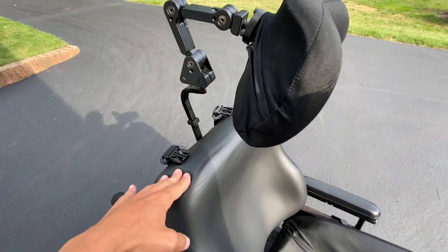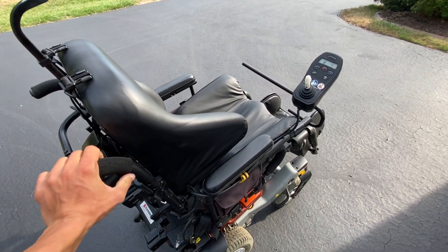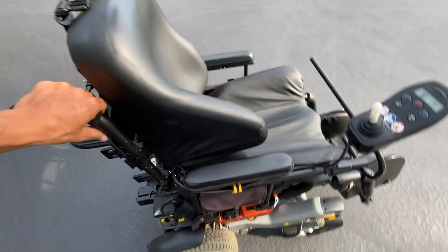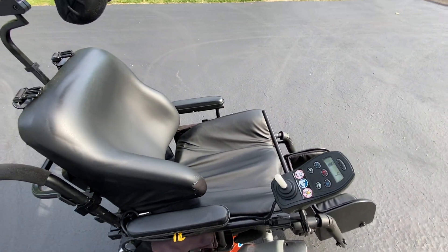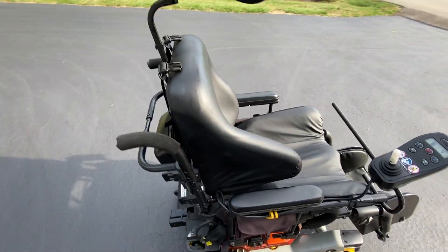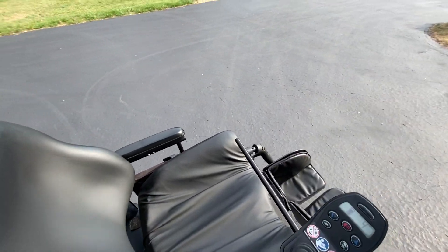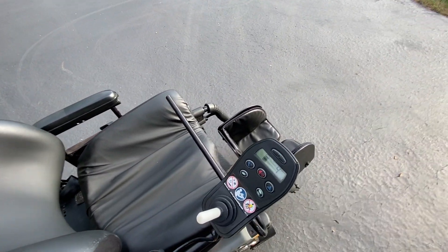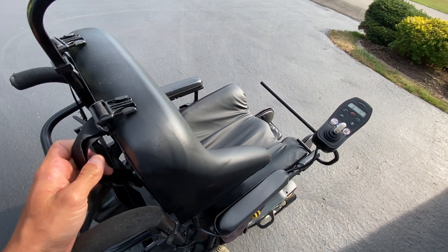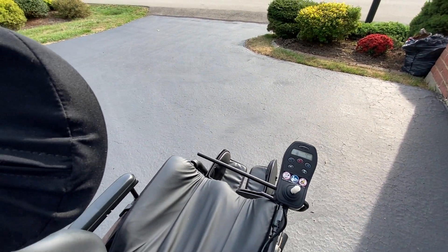My grandpa got this for $180 at a Salvation Army here where he lives in Pennsylvania. He looked it up and asked me, would it be a good idea to get this? He showed me pictures and I told him, go ahead and get it immediately — don't even hesitate, just get the chair. He went ahead and got it, and this thing is absolutely awesome.